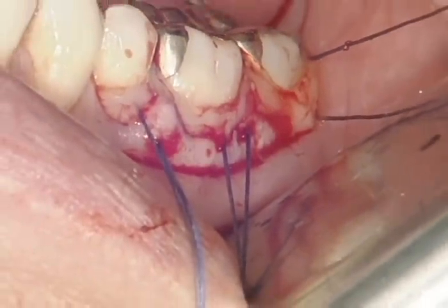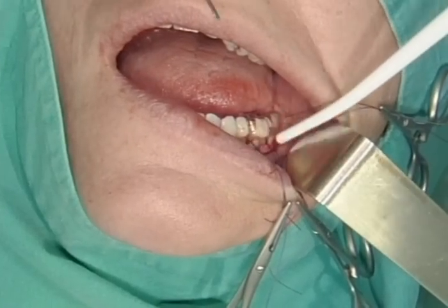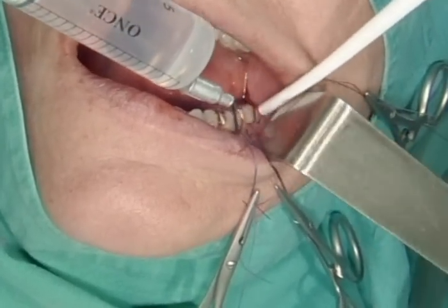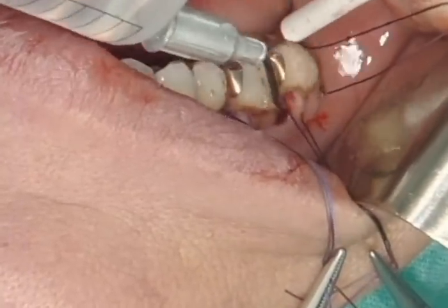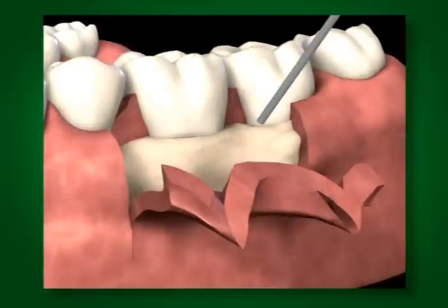The same procedure is applied to the lingual aspect. After 2 minutes, the site is rinsed again with sterile saline solution. All contact with blood, or especially saliva, on the root surface should be avoided. Less experienced surgeons can perform a larger flap opening, as shown in this graphic. That can help to better protect the root surface from contamination.